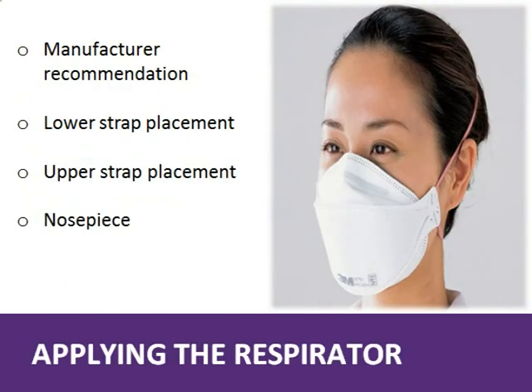Are all brands of respirators applied the same way? No, that would be too easy. That is why it is important that healthcare workers always consult the manufacturer's user instructions before putting on a new brand or model of respirator. Typically, for N95 respirators, the proper placement of head straps means that the lower strap should be worn around the neck and below the ears. The top strap should sit above the ears and around the crown of the head, securing the filter piece to the user's face. The facepiece should feel snug.